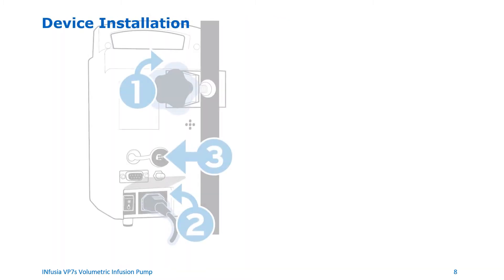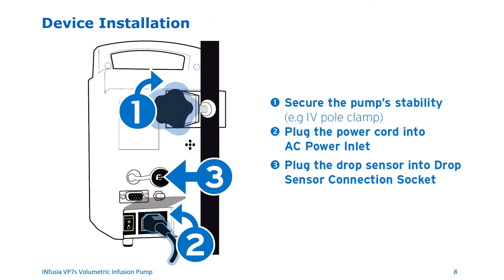Installation of the device. Use the pole clamp on the back of the device to attach the pump to an IV pole or to a cage. Plug the power cord into the AC power inlet and connect the drop sensor by plugging the sensor cable into the drop sensor connection socket in the back of the device.